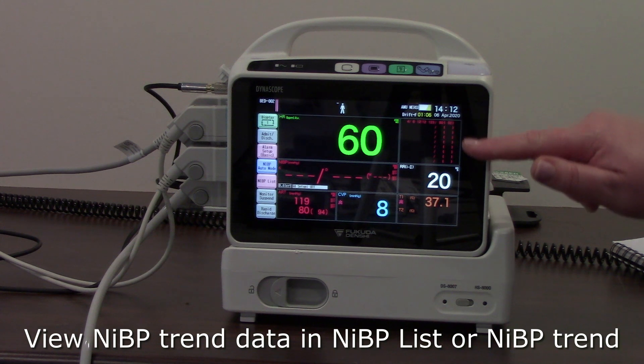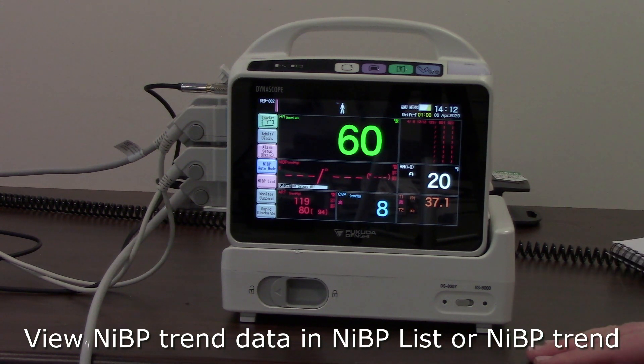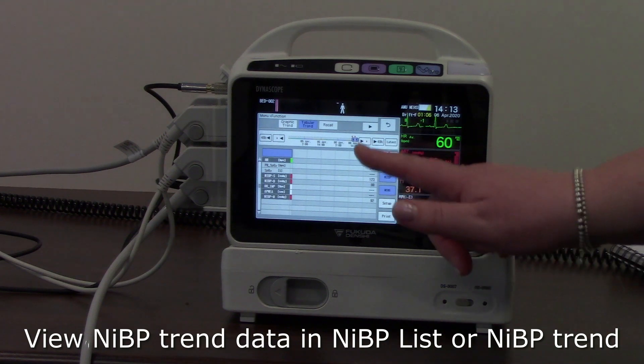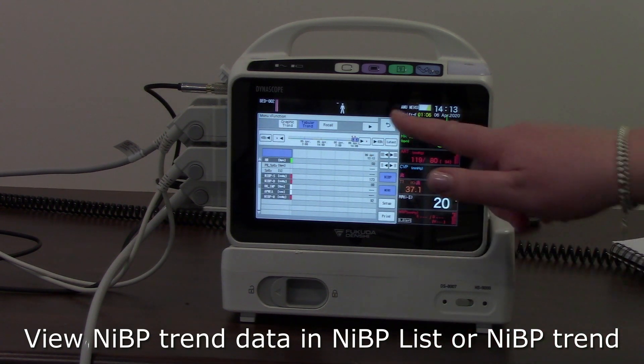You'll see all of those readings and measurements here in the blood pressure list. You can also access that on screen via a window, which will show all your non-invasive blood pressures and anything else that was monitored or measured at the same time.